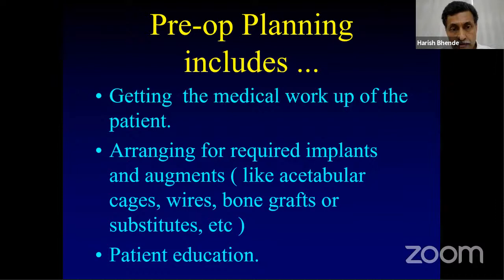As I mentioned, you may need a small implant, especially in a female patient. You may end up using 38 or 40 millimeter cups, and these cups are not easily available. Usually non-cemented cups are available from the size 44 or 46. So you have to ask the company specifically in some cases, like the one which I showed you, to keep small cups available to you on table. Otherwise, you may end up having a big trouble on table.